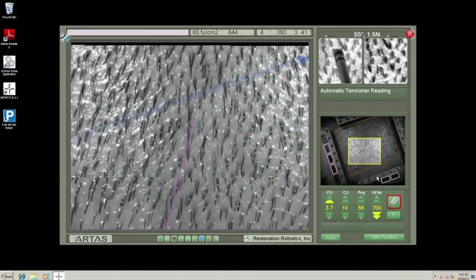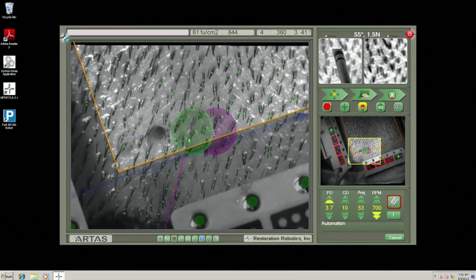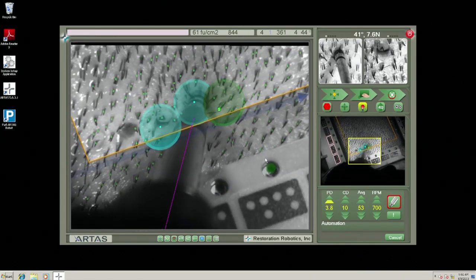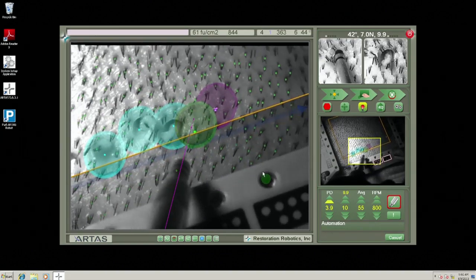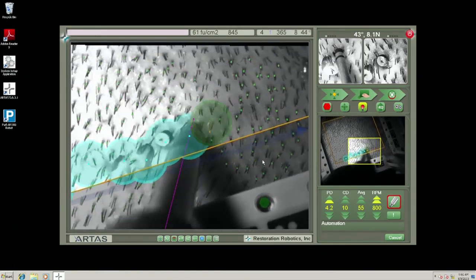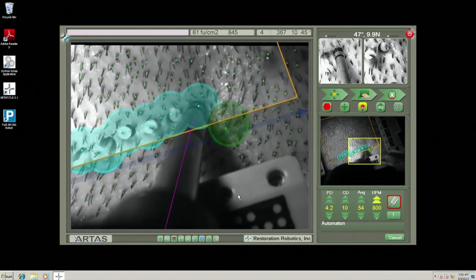Yes, there is. There's actually a profile of the actual tensioner. As the angle of the grafts dissect, the angles are pointed towards the lower end of the actual tensioner. When we approach this area, we're limited by the profile of this device, and so we have to respect the profile so that this needle device doesn't bounce off of it routinely. Now, there's a built-in no-fly zone indicated by the yellow line, so nothing below this can be really attacked. Because if you think about that, the angle would transect that graft, and we don't want to transect them, so we're going to cheat up a little bit away and come in that way.